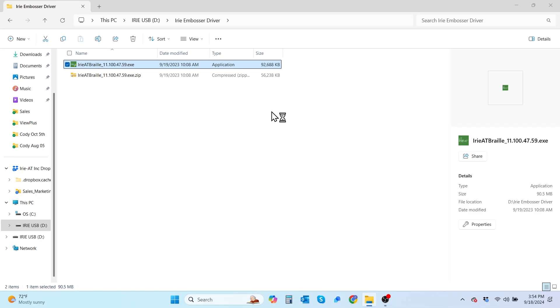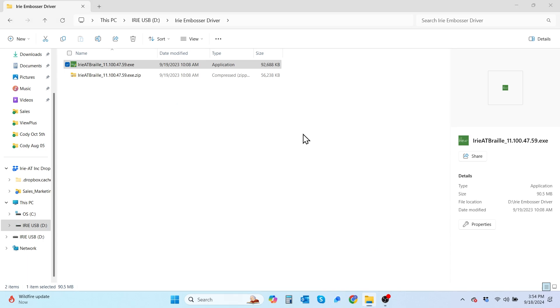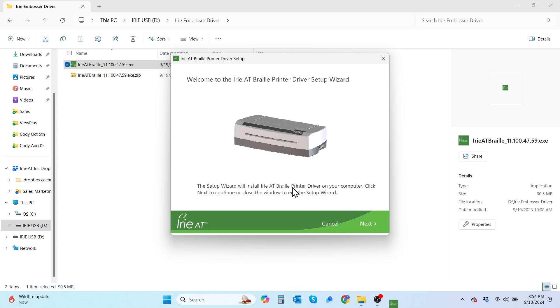When we do that, we're going to get a dialog box that says, do you wish to allow this app to make changes to your PC or to your device? We're going to select yes. Then you're going to get the Irie AT Braille printer driver setup dialog box. The first option is to select the setup language — we're going to go with English, United States — then hit next. It's going to take you into the driver setup wizard, and you can just hit next again to follow the prompts.